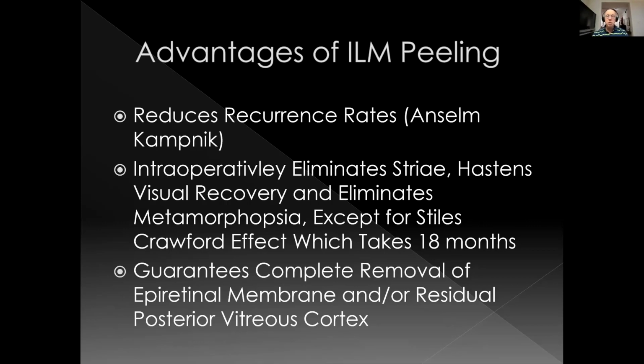And so, fortunately, photoreceptors adaptively realign at the nodal point, but it takes many, many months, and long after the retina appears normal on OCT. And so doctors that don't check the patient's vision 18 months or 2 years out have an incorrect impression about the level of visual improvement. I'm absolutely distraught if the patient is not 20/30 or better after epimacular membrane surgery, yet there are papers in the literature that believe that 20/80s or 20/70s is an average outcome.